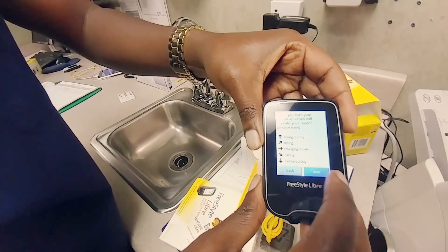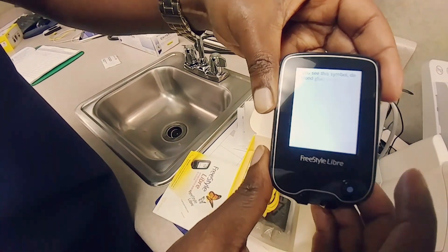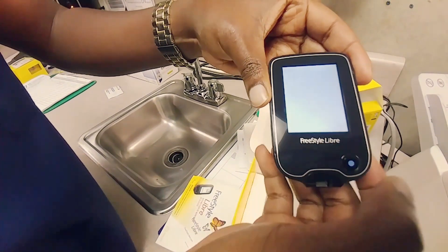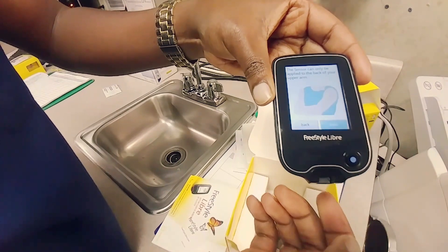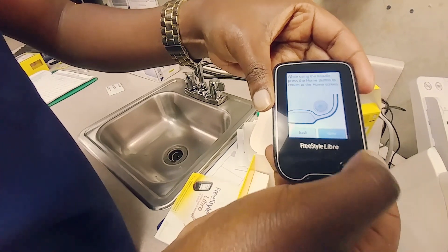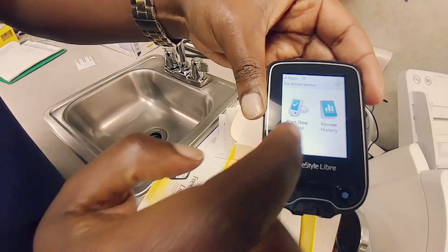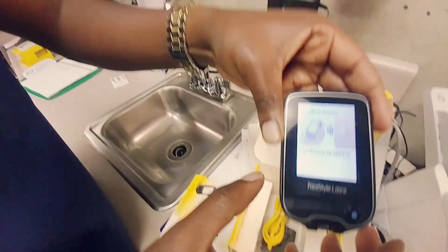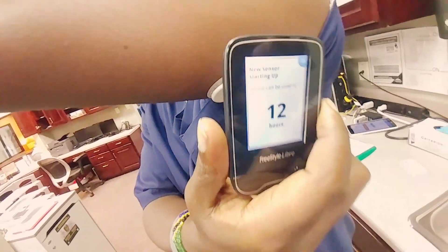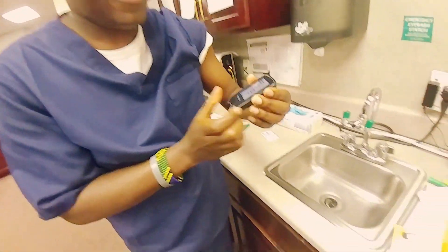Hit next, and it gives you instructions on what it's going to be telling you. When you read the blood sugar, you can also check your blood sugar here. It tells you how to read it, and that's your on/off button. Then hit 'start new sensor,' go ahead and scan your arm. It tells you 12 hours left before it will read — it's calibrating to your body right now.